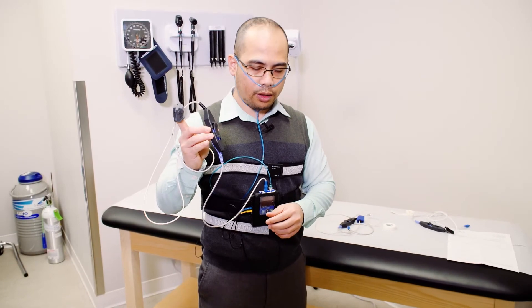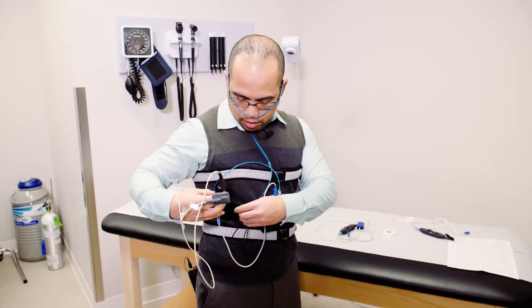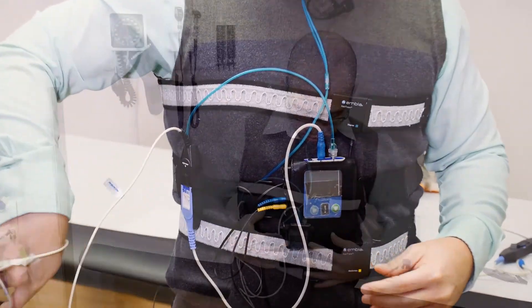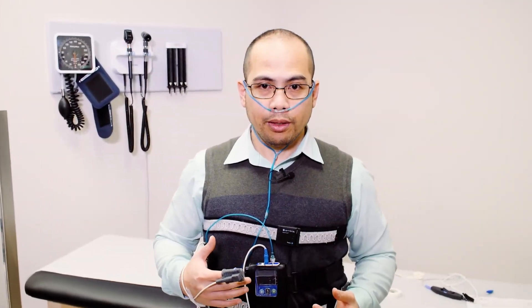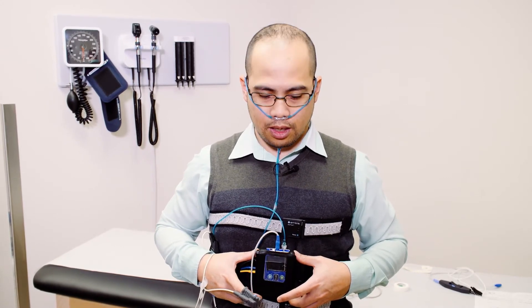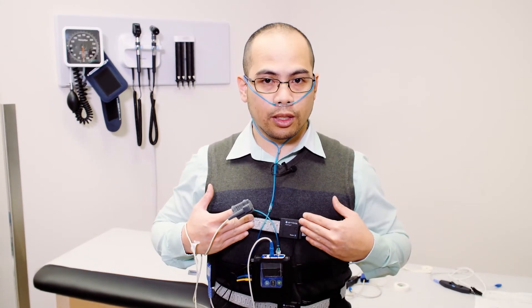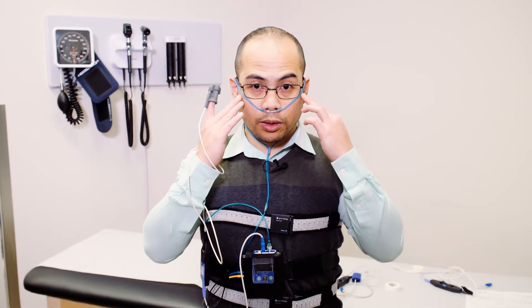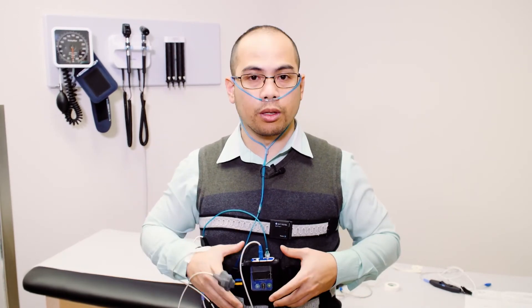You can clip the connector onto the Velcro belt. In summary, you will have the main recorder around your mid-trunk, the chest sensor and the belly sensor, the nose sensor, and lastly the finger sensor — all attached to the main recorder.